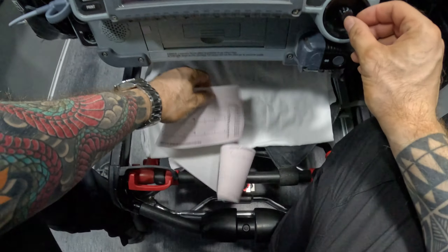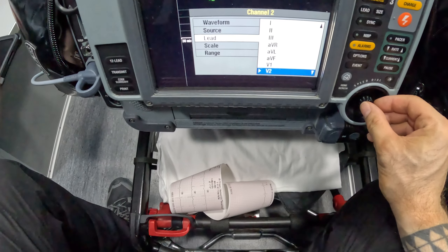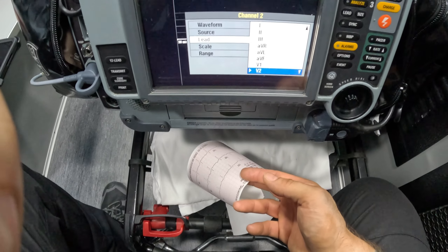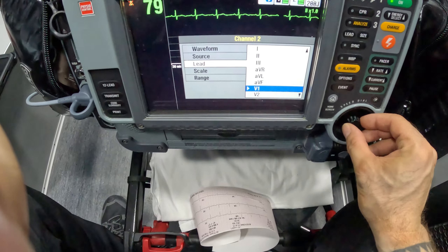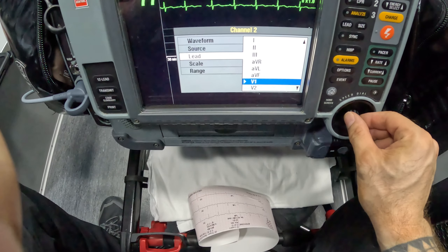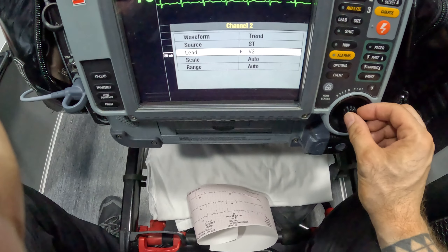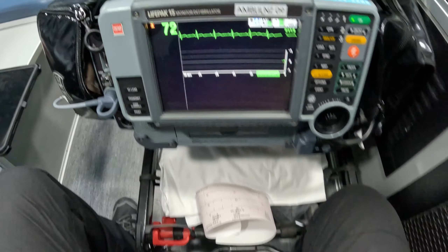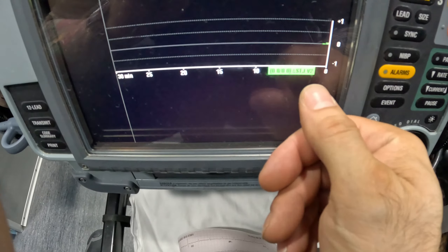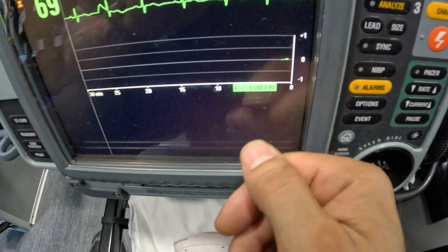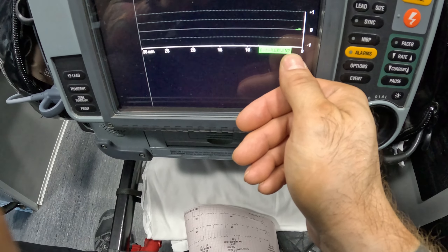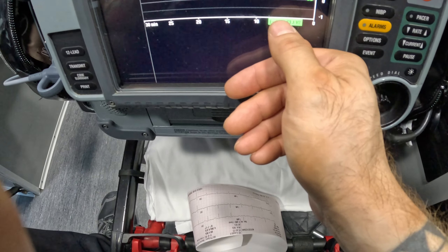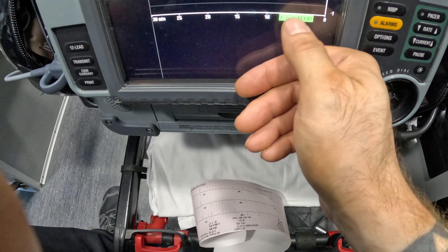But if you didn't want to employ the automatic response, you could select any other leads. So let's say you saw elevations in lead 3 that were the biggest, or you were concerned about inferior wall MI — you could select the appropriate leads. I'm going to leave it in V2 just to show you. So once we select the trend and click home, we have a couple of things showing here. It shows you which lead it's monitoring — it shows you that it's monitoring V2 for ST segment deviation. And obviously there is nothing that occurred right now — you see these dashes because there was no deviation from the baseline.